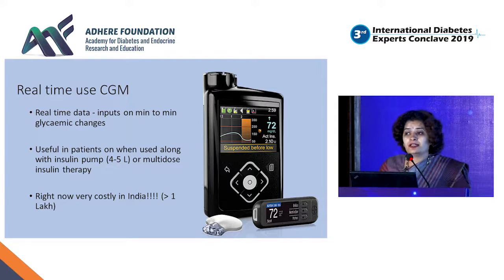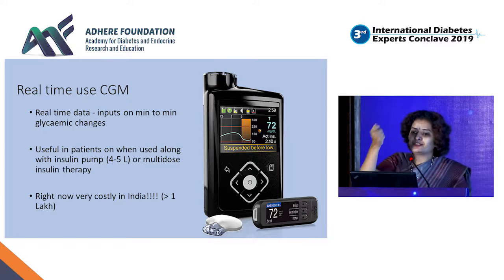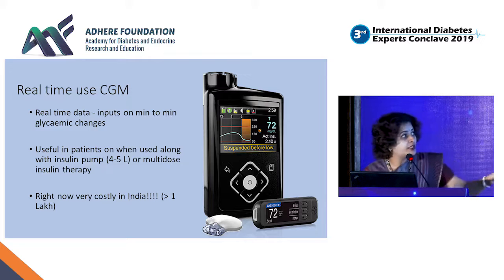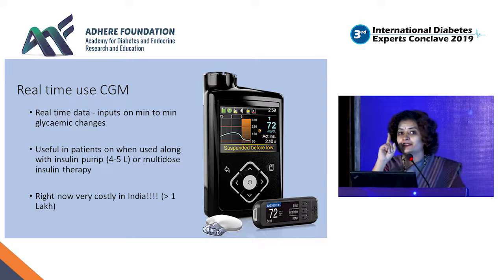And as Dr. Rakesh Sahai sir also said, my patient who was using a pump had better control when I put him on a sensor augmented pump, that is real-time monitoring plus pump, but he has stopped using the sensor because it is giving him continuous alarms and he is irritated with it. He is also a doctor. But he is only using the pump now. He bought the sensor augmented 640G along with the pump. He invested in it, but now he is using that pump just as a normal Minimed pump and not using the sensor. So you have to be very careful before asking the patient to invest 4 to 5 lakh rupees in that sensor augmented pump, that the patient is really motivated and psychologically ready for using that sensor augmented pump and a continuous real-time feed of his blood glucose.